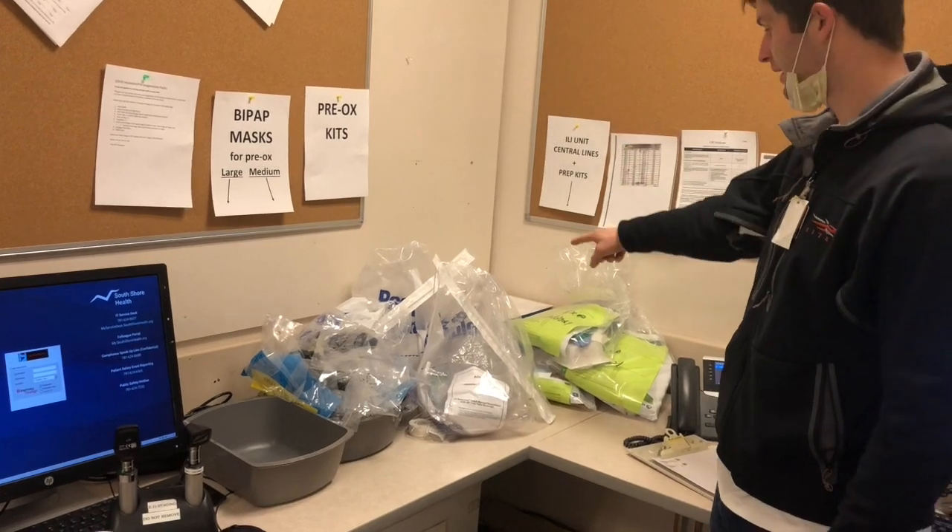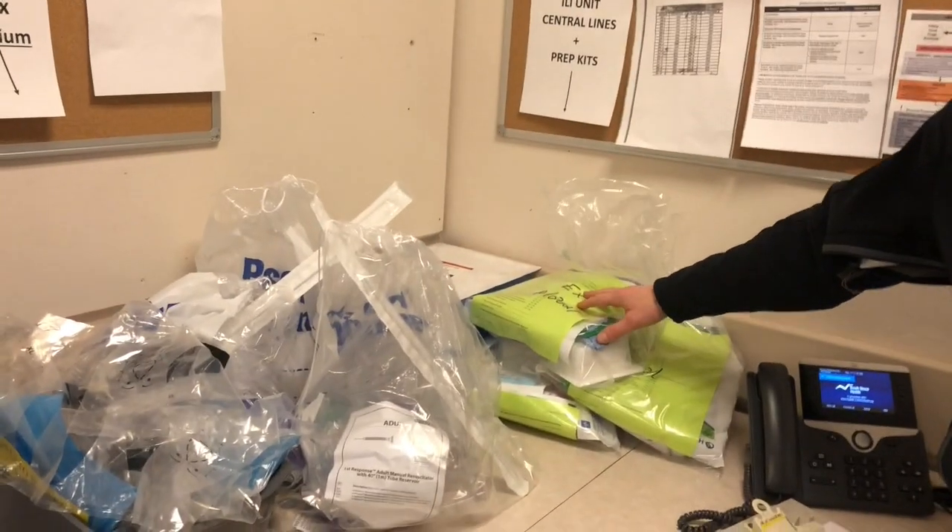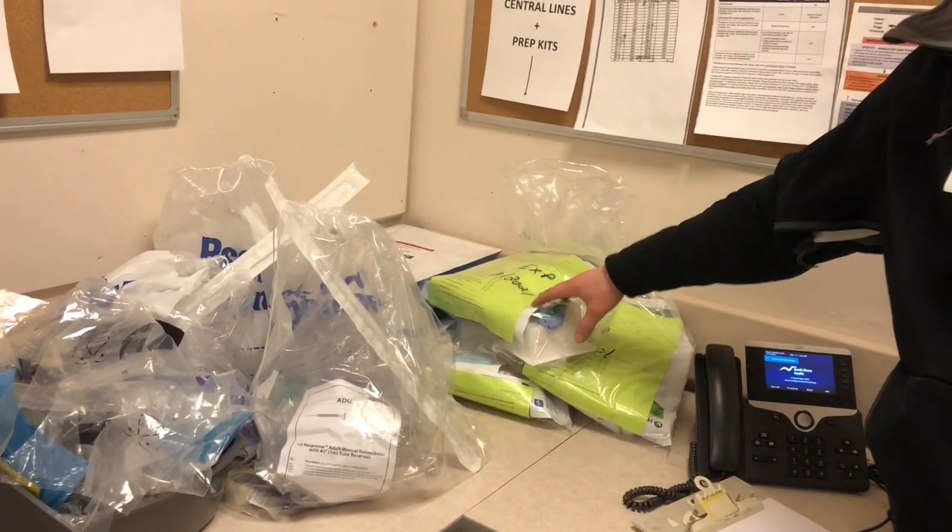Back in the ILI unit, we have the central line kits back in this corner here, and then we have the procedure prep kits in case you're needing to put a central line or do an invasive procedure on somebody.